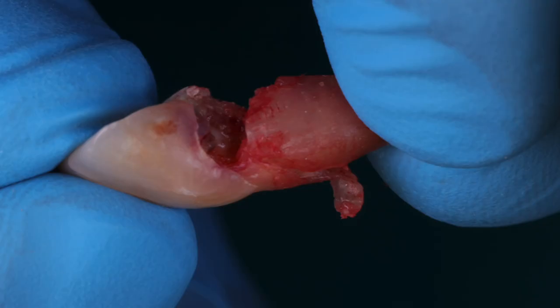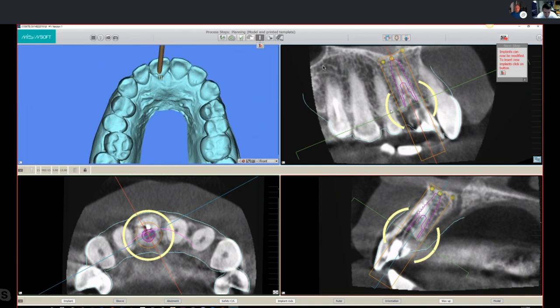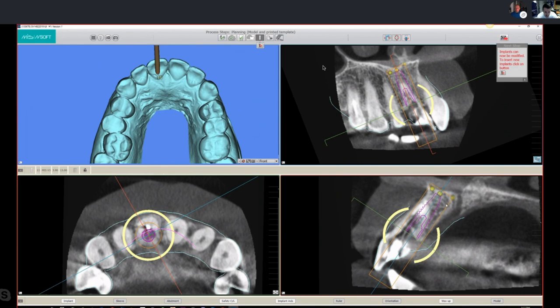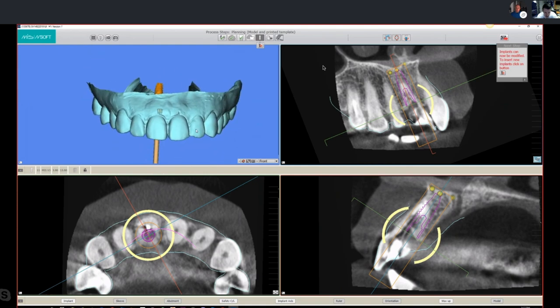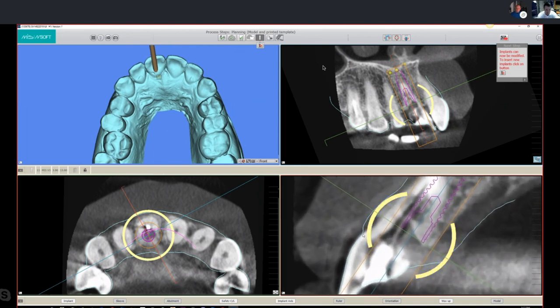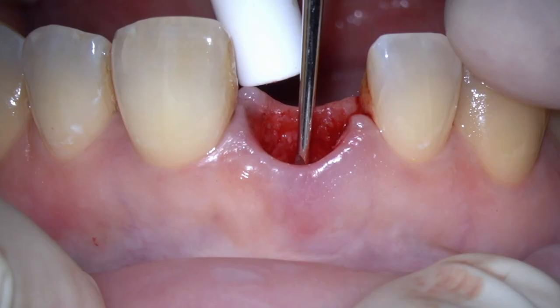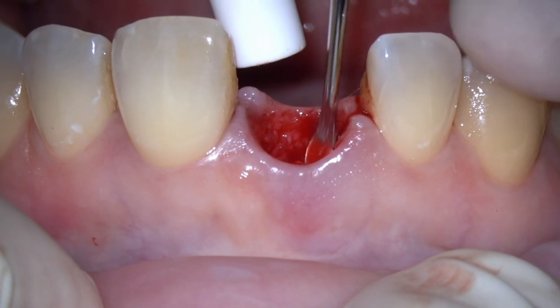Here is a picture of the extracted tooth showing the resorption. For implant placement we need planning. Working with Emil Bobev from Berlin, we position the implant to engage enough bone for primary stability. At the same time, I prefer the screw axis to be in the cingulum area so I can make a screw-retained crown, with a certain depth to create a good emerging profile for the tissues and transmucosal components. With the M guide we can achieve a very predictable position. After extraction we briefly clean the socket.